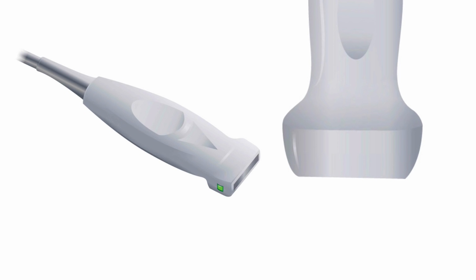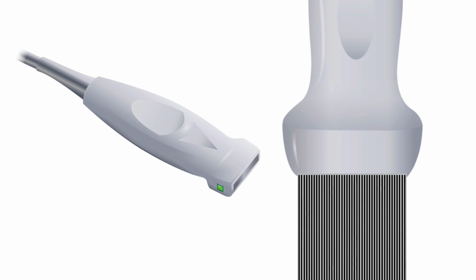Now, there's multiple types of probes, and depending on your type of ultrasound system, they may look slightly different based on the casing and the model. While ultrasound probes are designed differently by different manufacturers, the basic types of probes are similar throughout. You can see the linear array, which is a rectangular face, and this sends out beams in a very parallel fashion, giving you a rectangular display on the ultrasound screen.